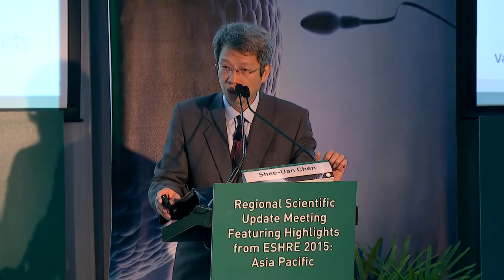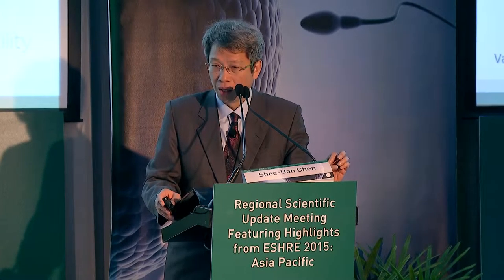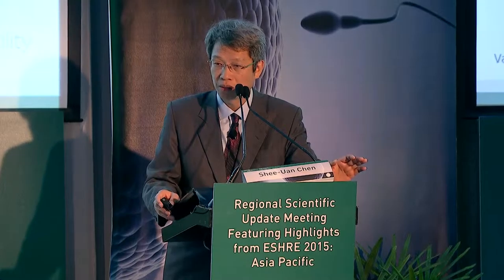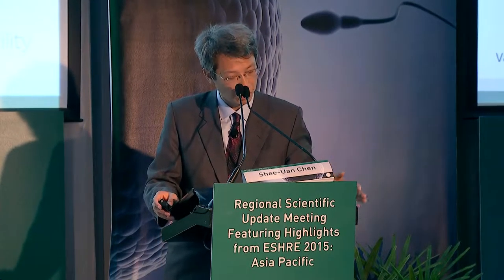This is a retrospective study of vitrification with a closed system. The good quality surplus embryos were vitrified using the Irvine vitrification kit. High security straws is a closed system, used on the day of embryo, such as day 2, day 3, day 4. After warming, embryos were cultured for 24 hours before transfer in a natural cycle or in a hormone replacement cycle.